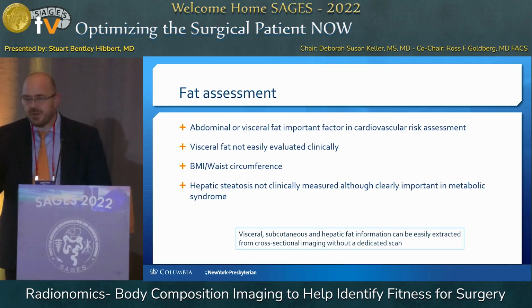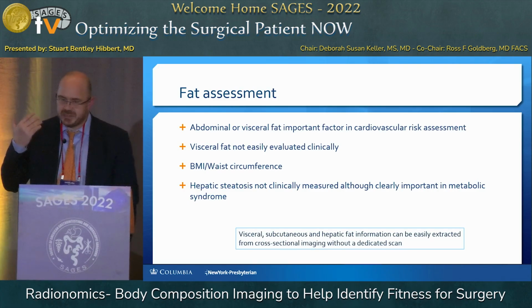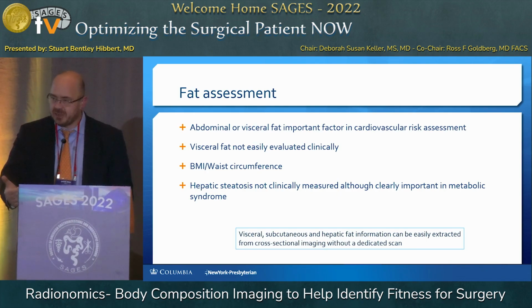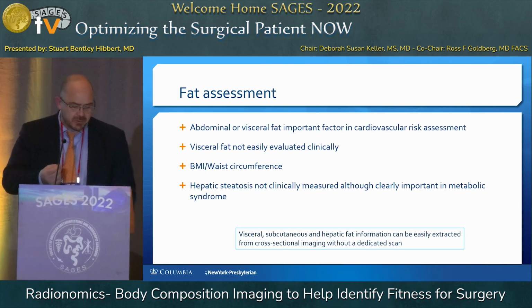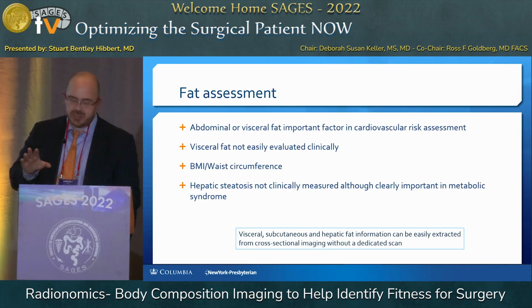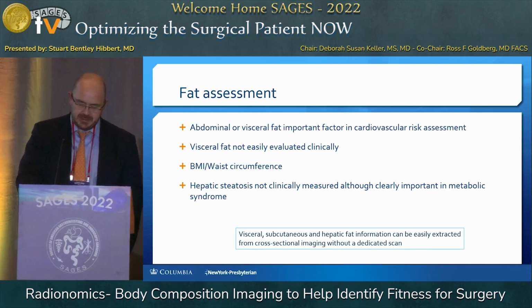Fatty liver, not easy. We know fatty liver is a problem. We know NAFL and NASH are all significant health factors. We cannot get that from a purely clinical assessment. Visceral, subcutaneous, and hepatic fat can be easily extracted from cross-sectional imaging without the need for a dedicated scan.